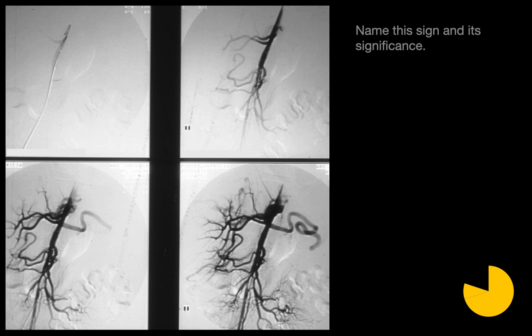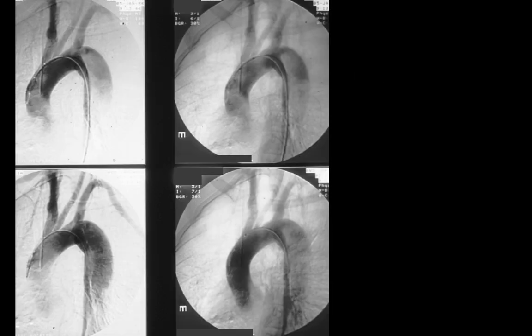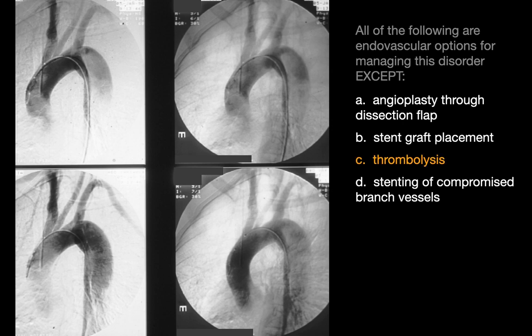This is called the floating viscera sign, and it is an indicator of a possible aortic dissection. What we see here is a pigtail catheter angiogram performed via the aorta. Endovascular options for managing this disorder — except thrombolysis — include angioplasty through the dissection flap, stent graft placement, and stenting of compromised branch vessels.